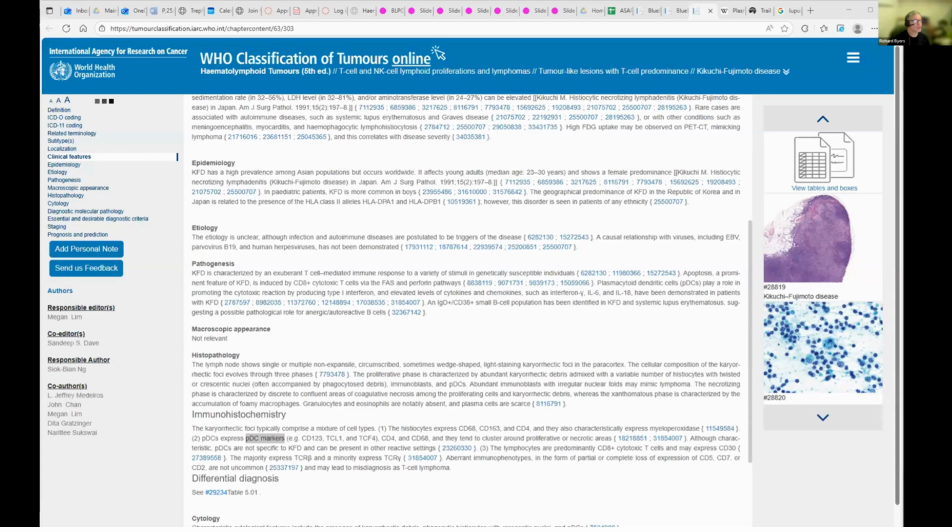So who thinks this is what? What votes have we got in the chat, please, for either lupus or Kikuchi's?